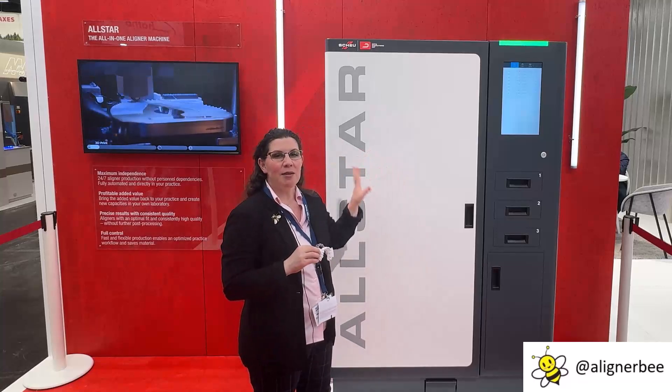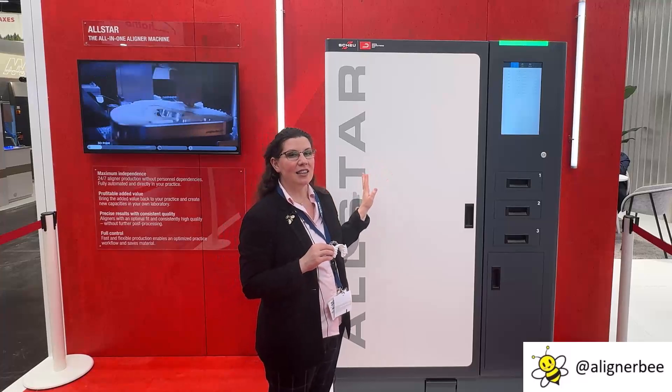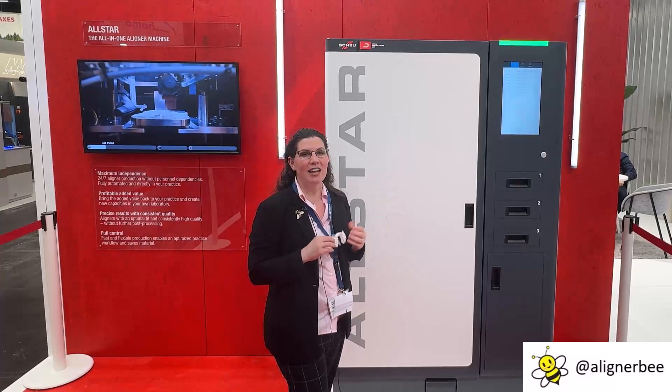In the unit behind me, the entire system is contained. All it needs is electrical and ethernet added so that you can connect it to the ethernet in your office.